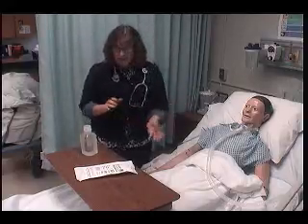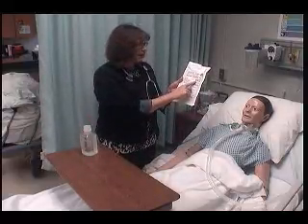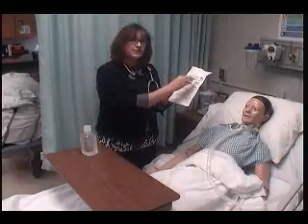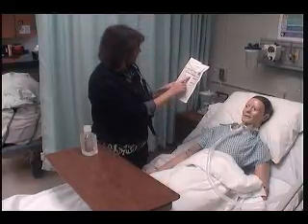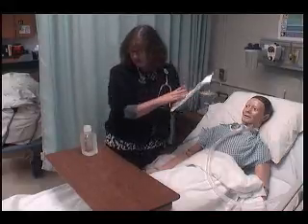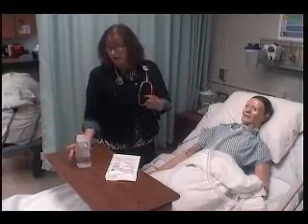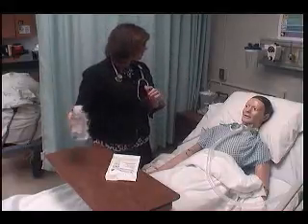I'm going to go ahead and start the procedure. I need to make sure I have my equipment. I want a suction catheter kit — there are different sizes. I'm going to use the 12 French; 12 is smaller than a 14, and 10 is smaller than a 12. The kit has one suction catheter, one pop-up solution cup, and two powder-free latex-free gloves. This is a sterile kit. I'm also making sure I have sterile saline — a brand new bottle. It's good for 24 hours once open if you can assure sterility.